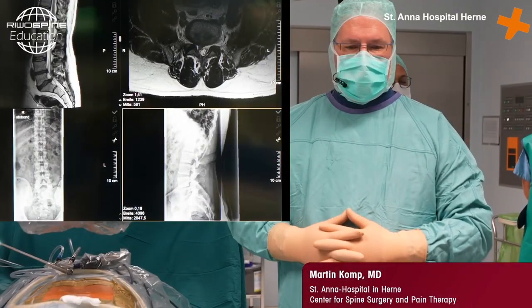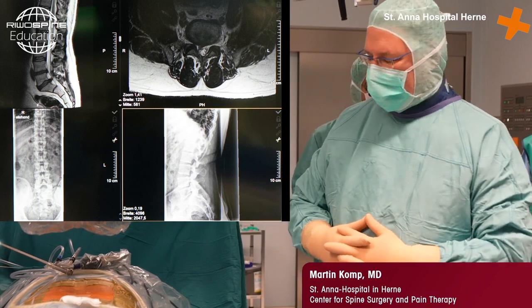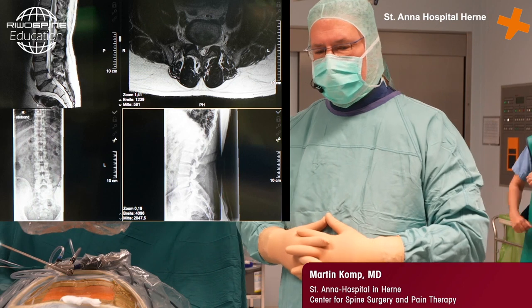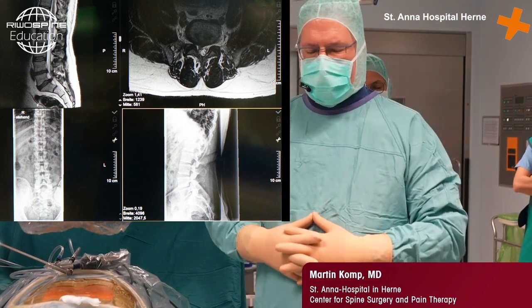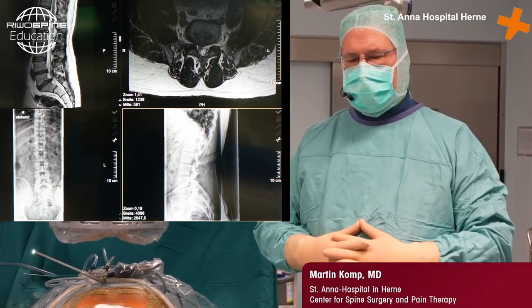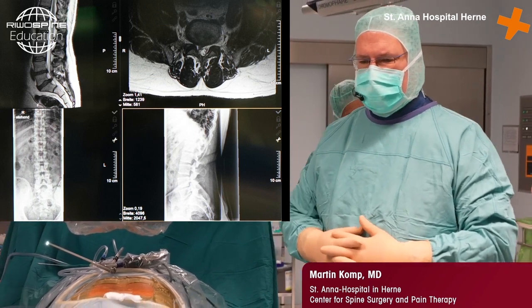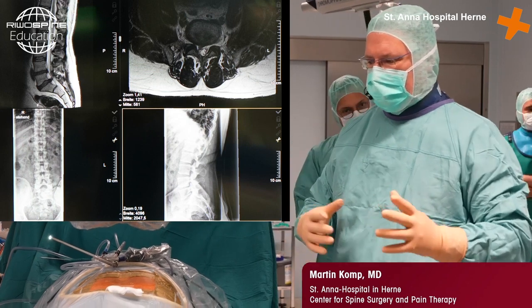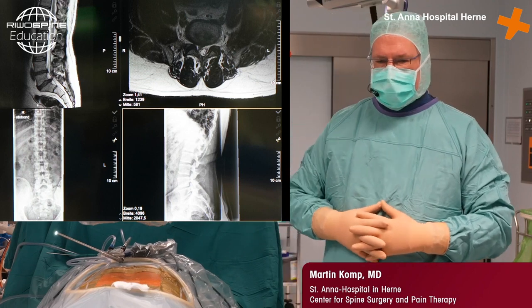Today we will broadcast some of our daily operations, and we prepared 4 cases. First we start with a normal interlaminar case, then an interlaminar case as a recurrence after open surgery. Then we will have an interlaminar case with bone resection, far sequestrated herniation, and we will end with an extraforaminal herniation. So I think we will have a good overview about the possibilities with this technique.